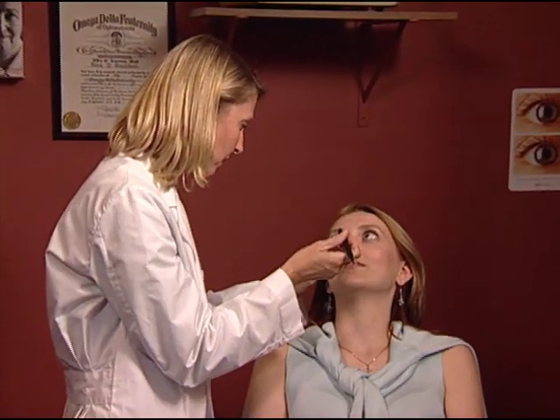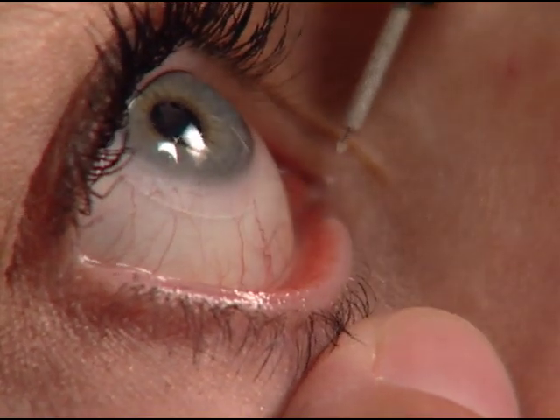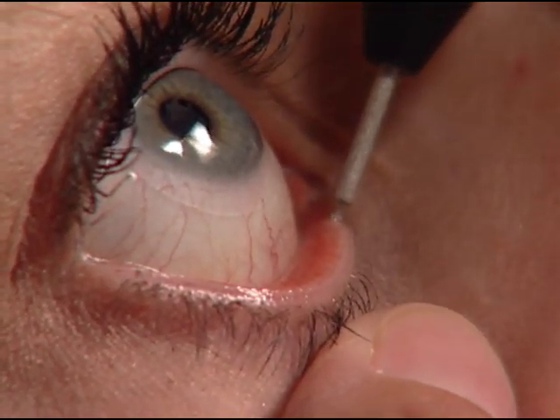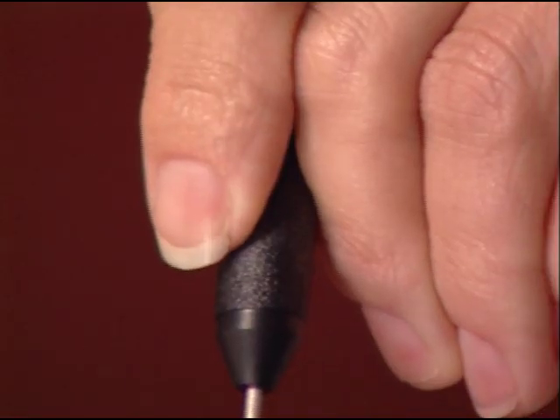All I'm going to do is pull your lower lid down a little bit. I just want you to look up towards the ceiling. Gently insert the parasol plug into the punctum until the dome is flush with the lid margin. Then press the release button.